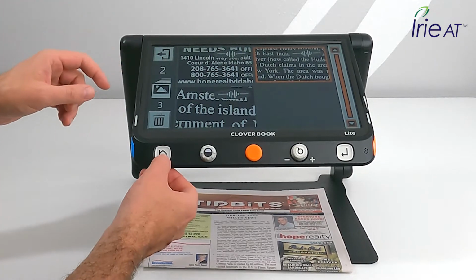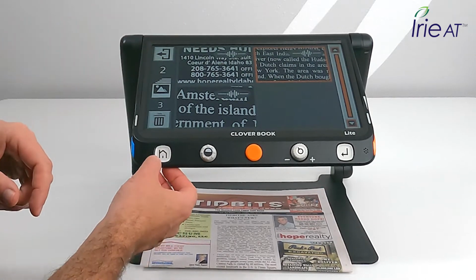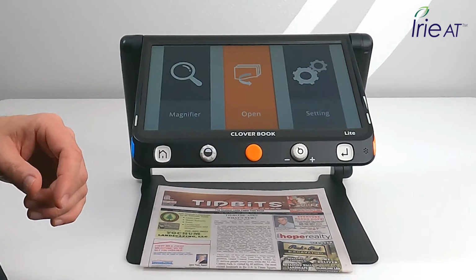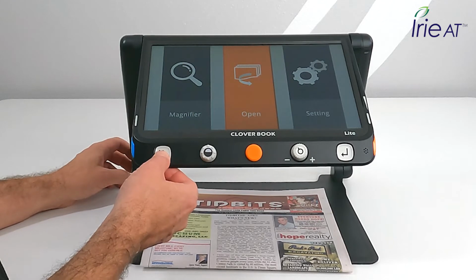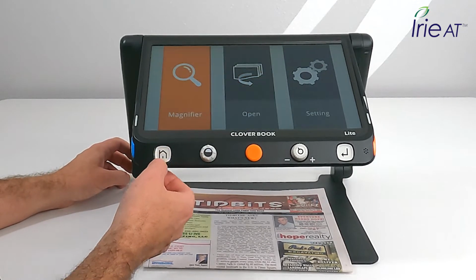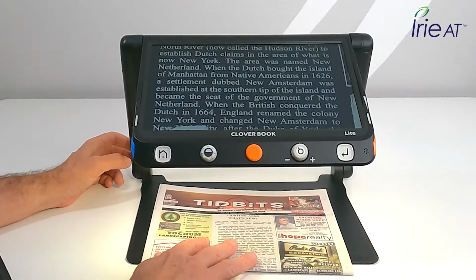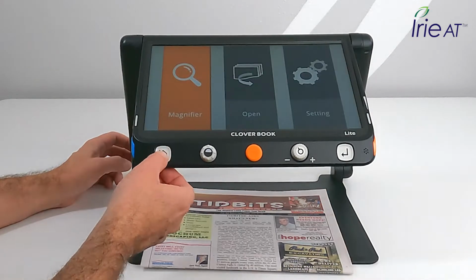And then you can always hit the home button to go back, or there's a back icon that shows up on here. And you just back out, and you can go to the menu. You can also always long press on the home button, and that'll bring you back out if you don't know where you are. Magnifier, near view. That'll bring you back out to your magnifier so you can get back in action. I'm going to long press that home button again and get back into the menus.